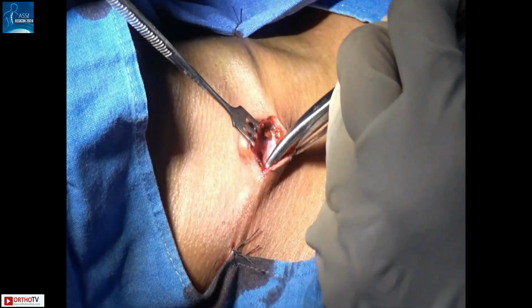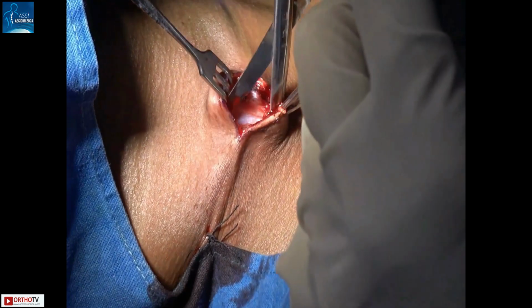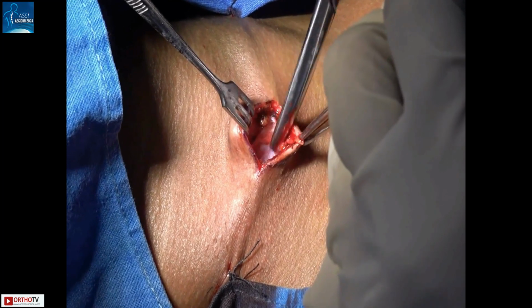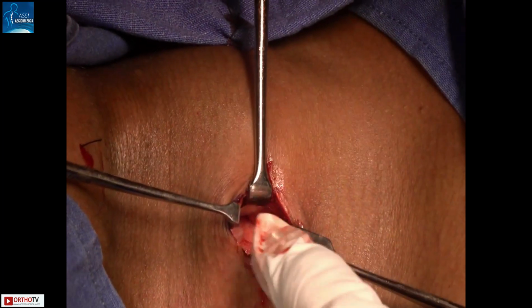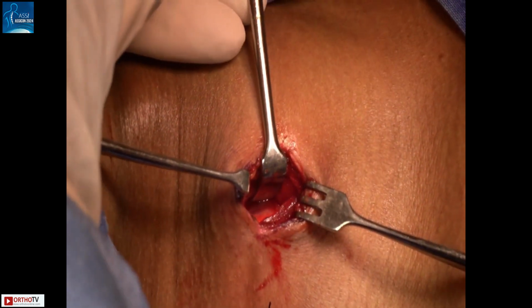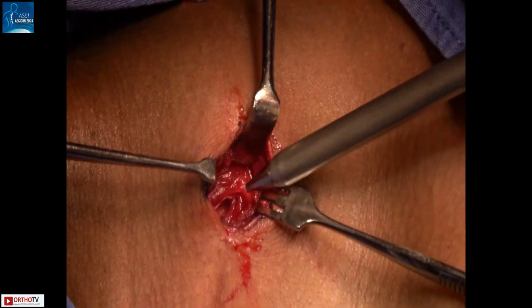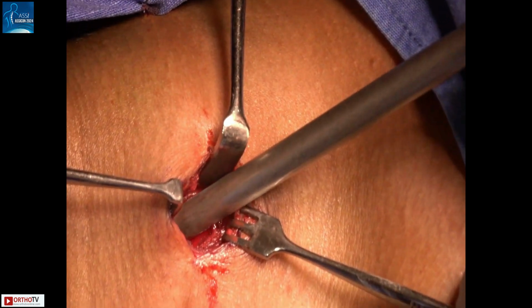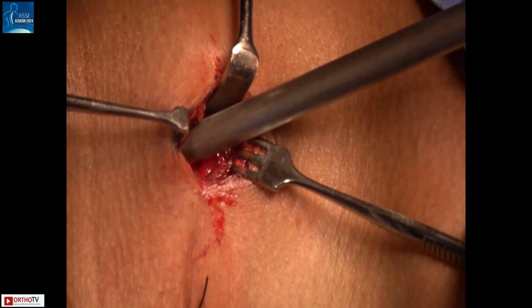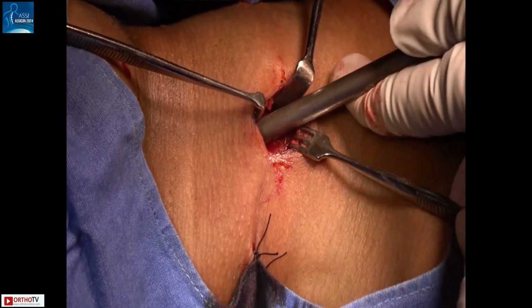Then it is a classical anterior Smith-Robinson approach. You cut the platysma, get the plane medial to the sternocleidomastoid, and then feel for the carotid pulse, and you have to be medial to the carotid. That is, the carotid sheath on the left side and the tracheoesophageal structures on the other side. Use the cannulated sleeve, then guide it slowly to the base of the C2.